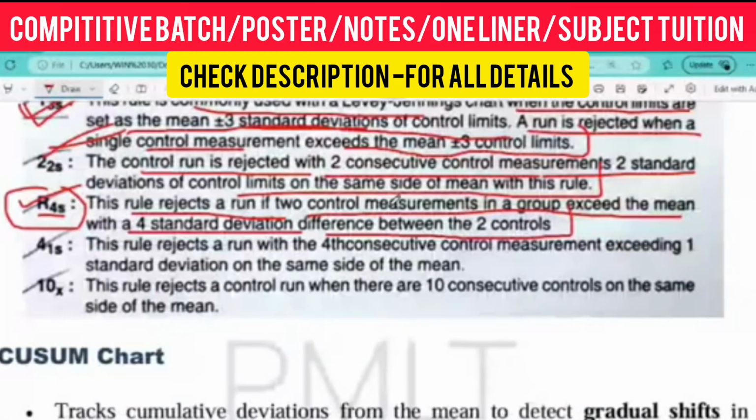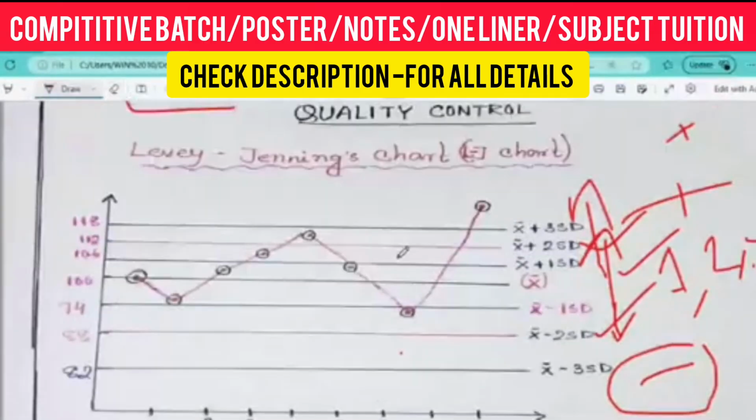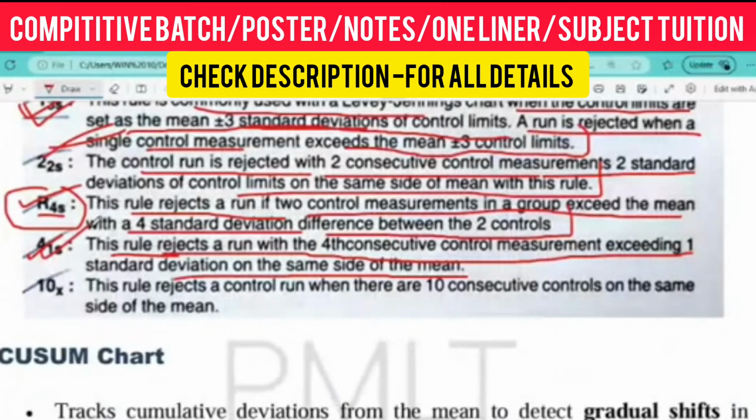Is it too hard? No, sir. The thing is hard, but if you understand it, it becomes easy. Next the 4 1s rule: reject when four consecutive control measurements exceed one standard deviation on the same side of the mean. Getting my point? That is 1. If it repeatedly exceeds 1s four times, 1 1 1 1, that is called 4 1s. That is also rejected. Understand?